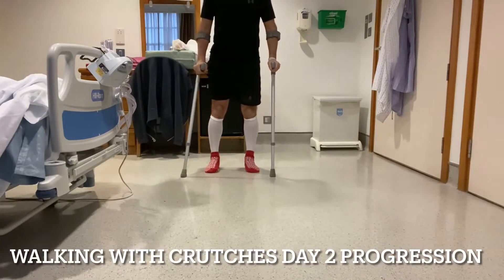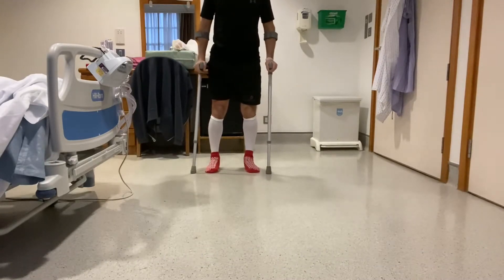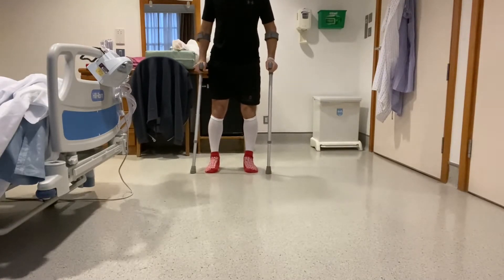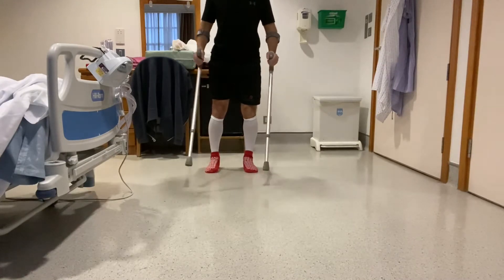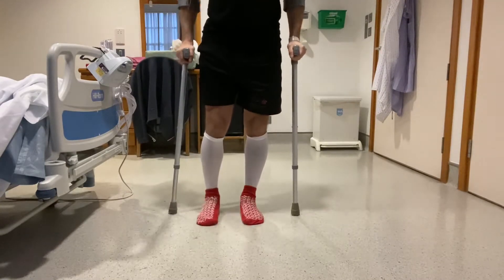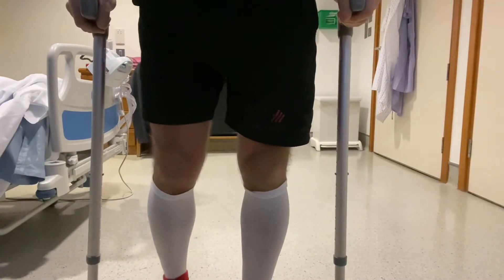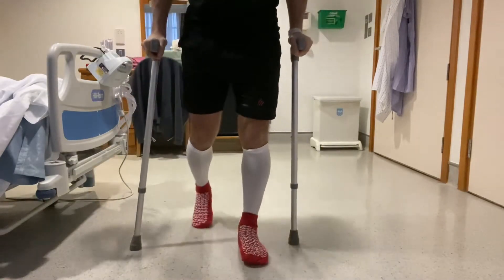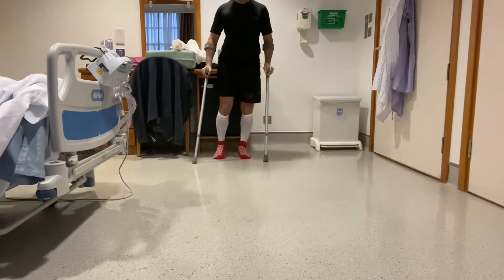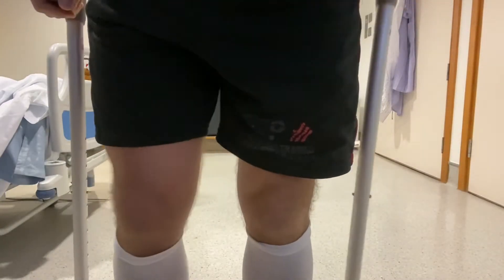By day two I was feeling more confident on the crutches and with the physio's advice I was recommended to try a more normal walking gait pattern where I was able to alternate legs, or even swing the leg through as in a normal walking gait pattern.